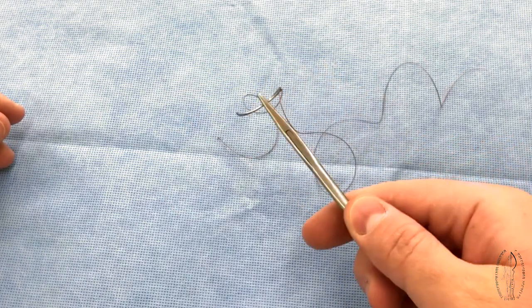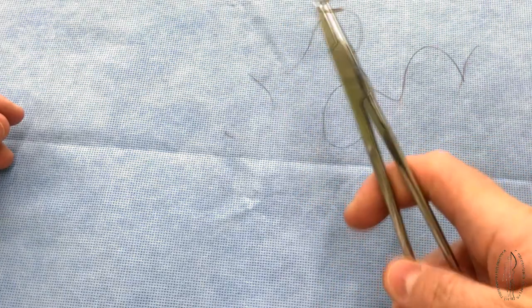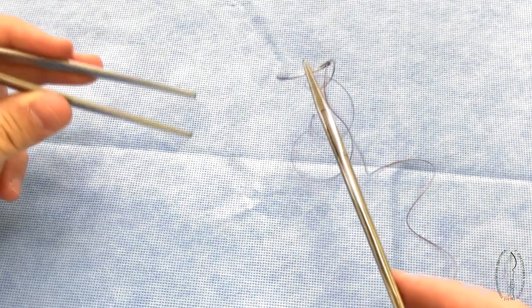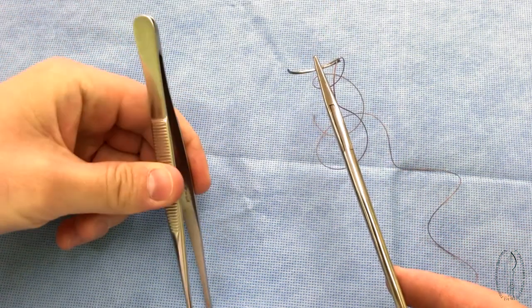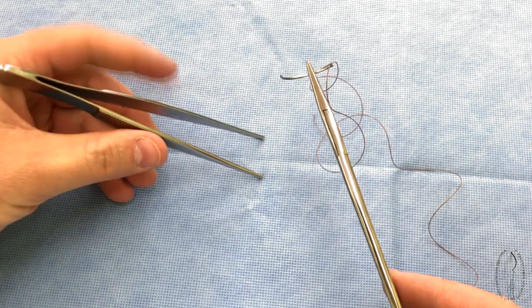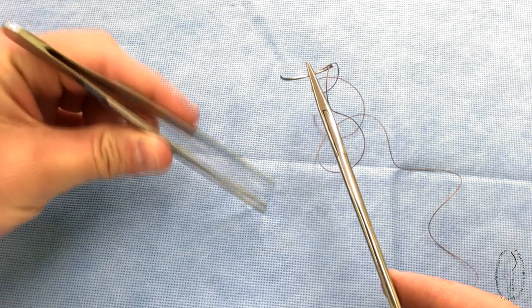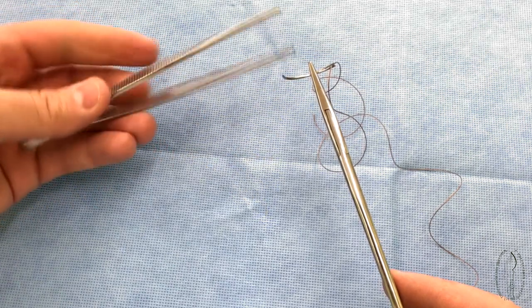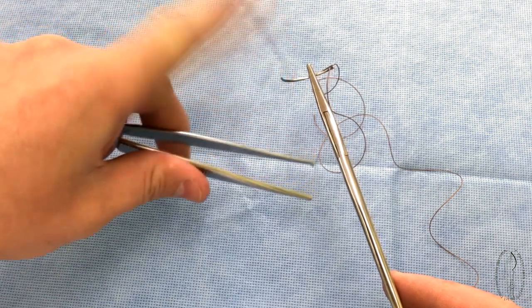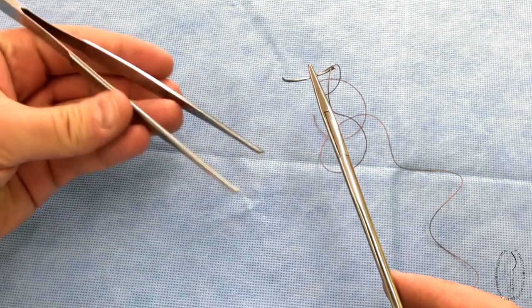Movements of the needle holder together with the hand and forearm should be rotational, repeating the curvature of the needle. Also, for the majority of sutures, pincers or tweezers are used, which are fixed in the other hand like a writing pen. The thumb is located on one side, the index and middle fingers on the other. The position of pincers in a fist is incorrect.